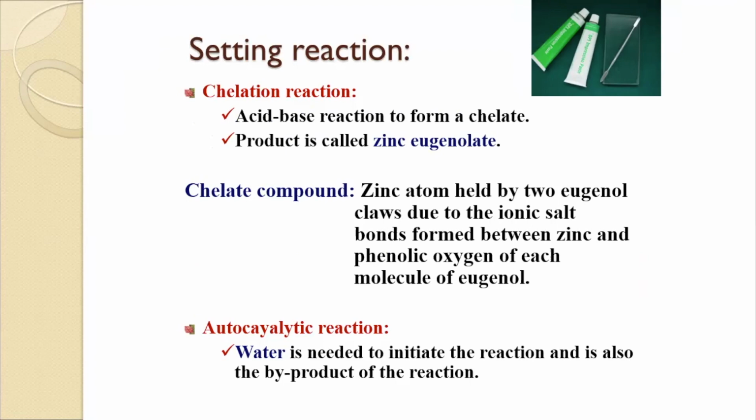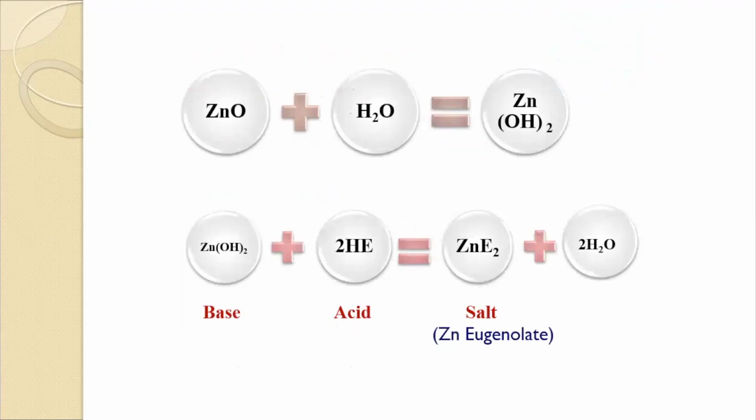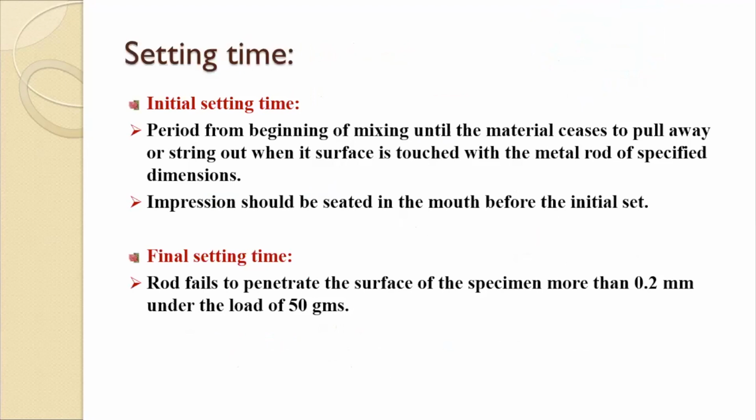Autocatalytic reaction: water is needed to initiate the reaction and is also the byproduct of this reaction. This is what happens basically. Also, while we are mixing, we can add Vaseline, cocoa butter, etc., while we are spatulating this mix.